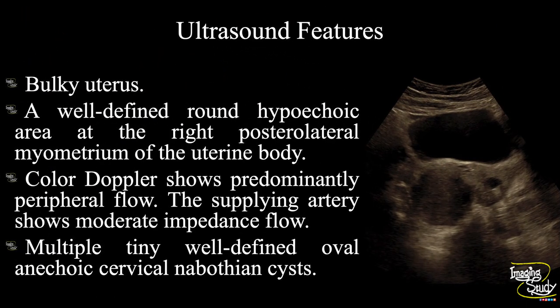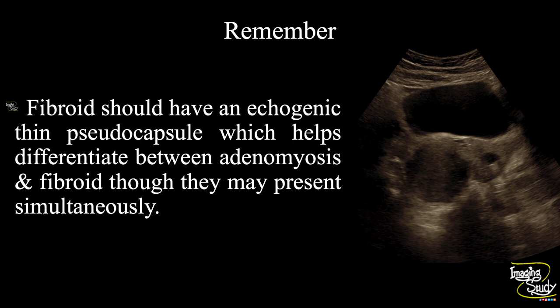In summary, a bulky uterus is seen. There is a well-defined round hypoechoic area at the right posterolateral myometrium of the uterine body indicating a uterine fibroid. Color Doppler shows predominantly peripheral flow, and the supplying artery shows moderate impedance flow. There are also tiny well-defined oval anechoic cystic spaces at the cervical region indicating nabothian cysts. The take-home message: the fibroid should have an echogenic thin pseudo capsule, which helps differentiate between adenomyosis and fibroid, though they may present simultaneously.